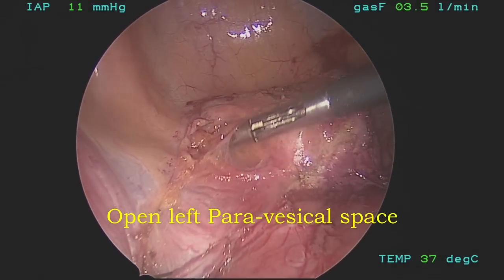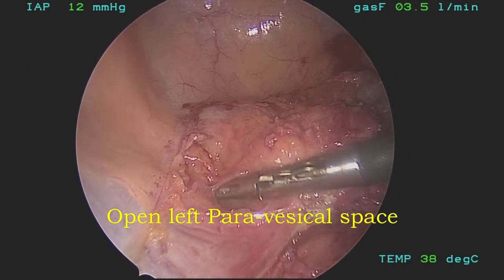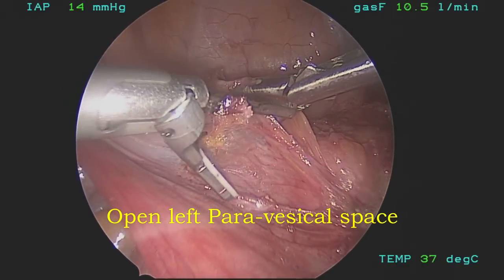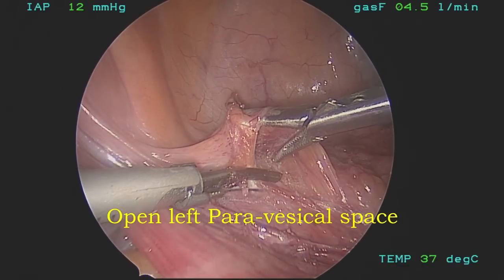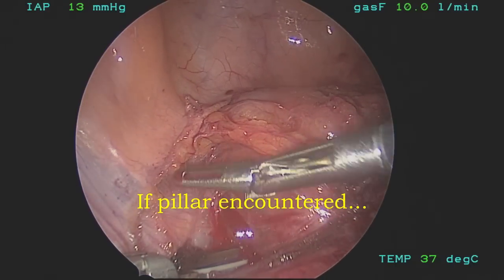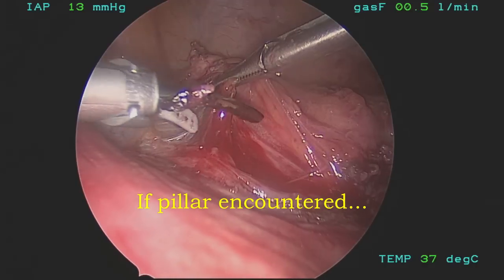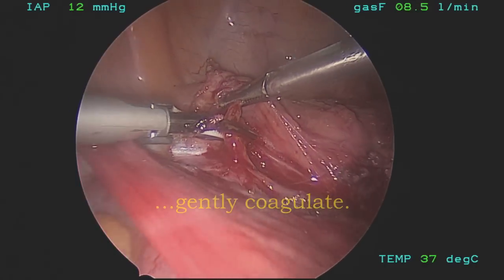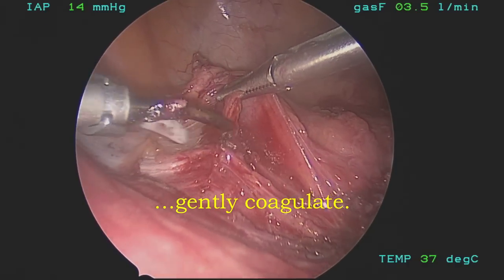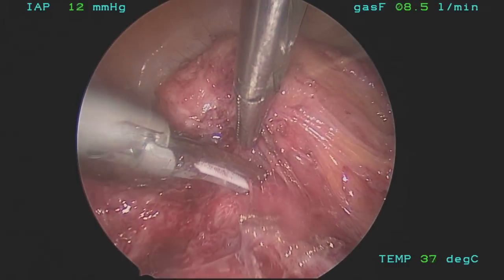Next, focus is on the left paravesical space, and you can see I am using a blunt dissector as well as harmonic energy. Sometimes a bladder pillar or a bladder vessel will be encountered during the dissection. If this occurs, try to avoid utilizing any electrical energy. Here the harmonic is applied to the blood vessel, activated on minimum, and gentle coagulation is performed, and now the dissection can continue.